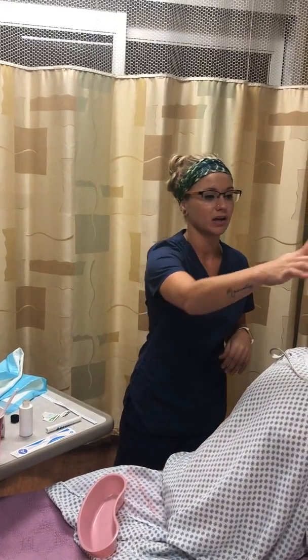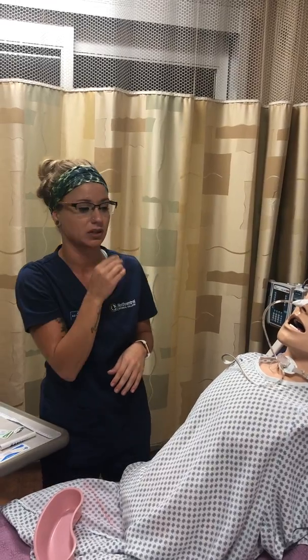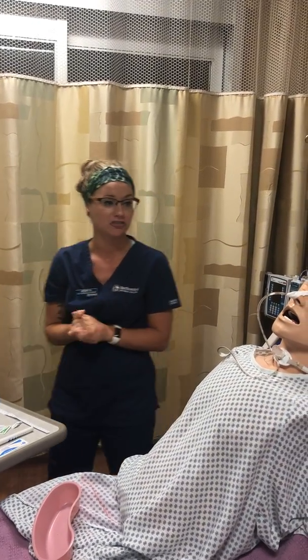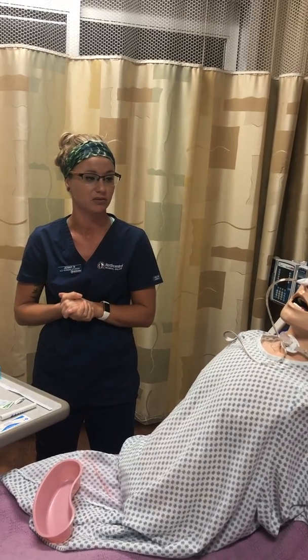And some lifespan variations: maybe you have an elderly client that may be confused at times, maybe has a tendency of pulling at lines. You might want to place a bridle, which is a securement device on their nose that keeps it in place. Or with pediatric clients, you want to make sure you have the appropriate size, the French size of the nasogastric tube.